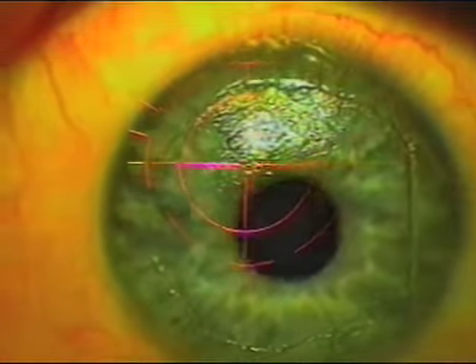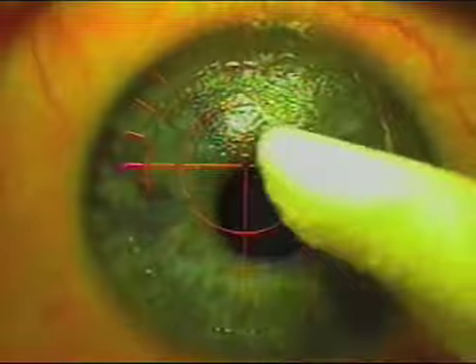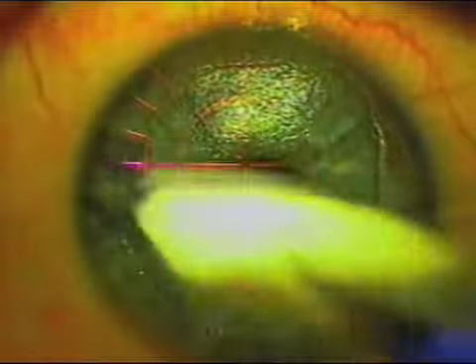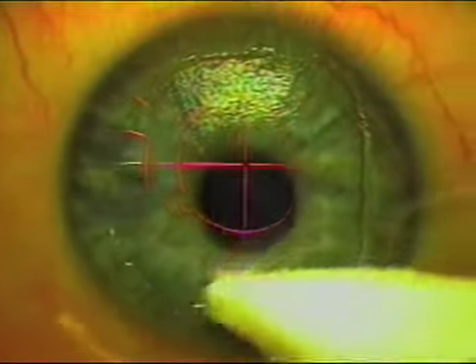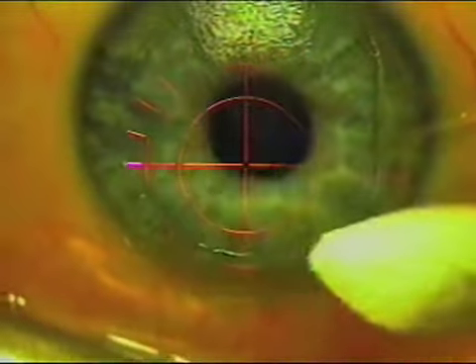And then one of the problems in any kind of enhancement where you're lifting that same flap is that the epithelial edges will oftentimes be adherent to the top part of the flap, and so it's important just to push the epithelium back out of the way. And again, this is a case of epithelial ingrowth in this specific situation, and so I'll make sure that I remove epithelium from the stromal bed in the areas where it was, but I'm also being very careful to make sure that the epithelium is back away from the stromal bed so that I don't lay that top flap back inadvertently over areas of epithelial cells.